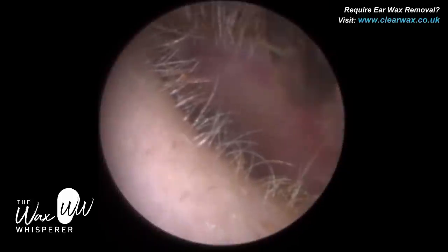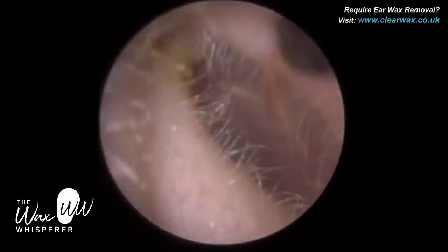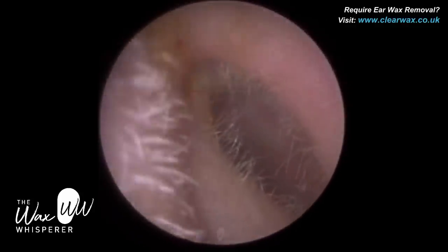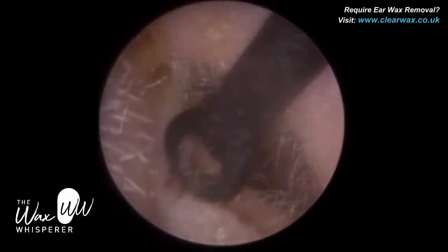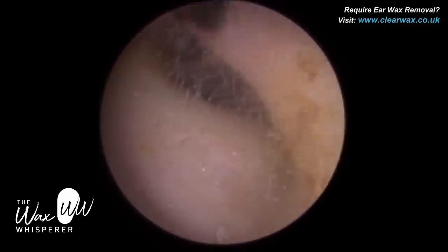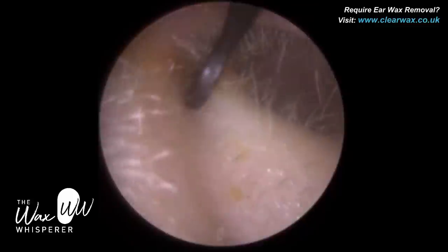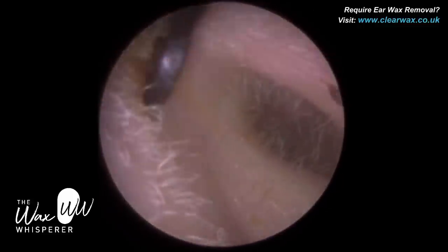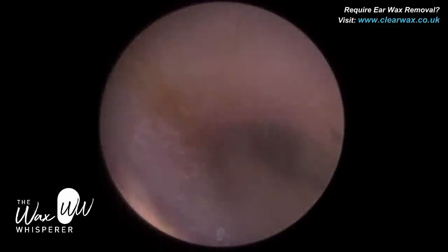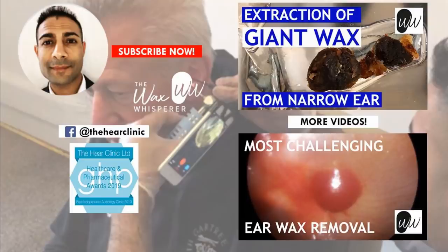So I'm just mopping up around the edge, and you can see the cilia there at the entrance of the ear canal — the little hair strands. They're there for a reason: they help to filtrate the air and trap any foreign bodies, particles, and dust from entering the ear canal. These hairs also secrete sebum, which is an oily substance that helps protect the skin of the ear canal from drying and cracking. They also help secrete the ceruminous glands, which are like a sweat-type gland. There's a small furuncle at the top of the ear canal — just a small pimple, nothing to be concerned about. I hope you enjoyed that video.